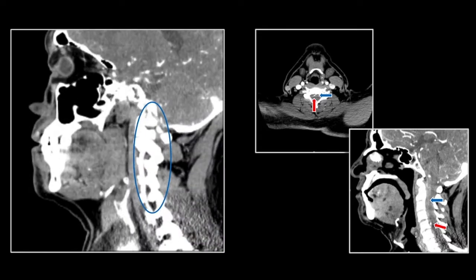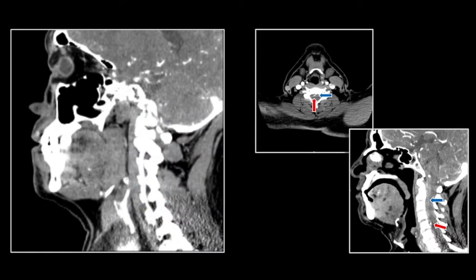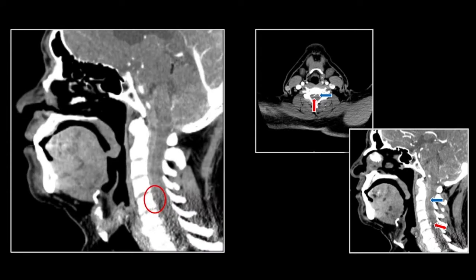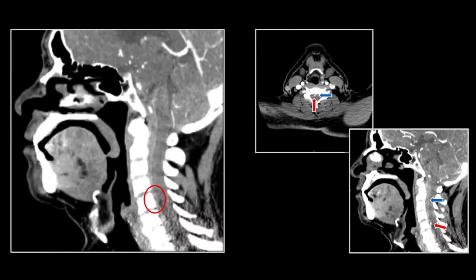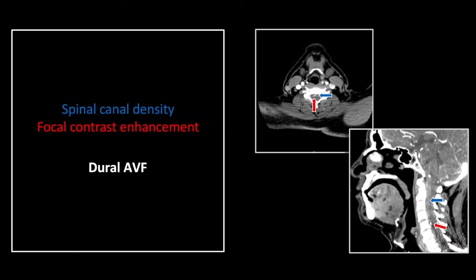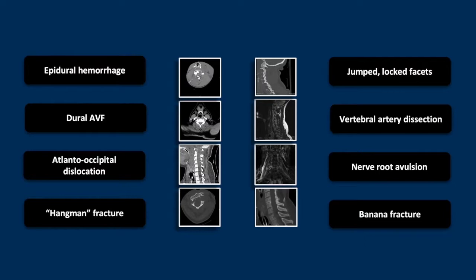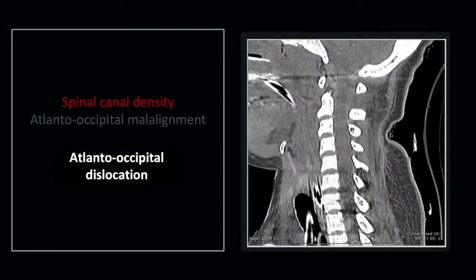There is that anterior density on the sagittal, and again the small dot of contrast enhancement — note the entering and exiting vessels. That was a traumatic dural arteriovenous fistula with extensive epidural hemorrhage. Our next case is an atlanto-occipital dislocation.